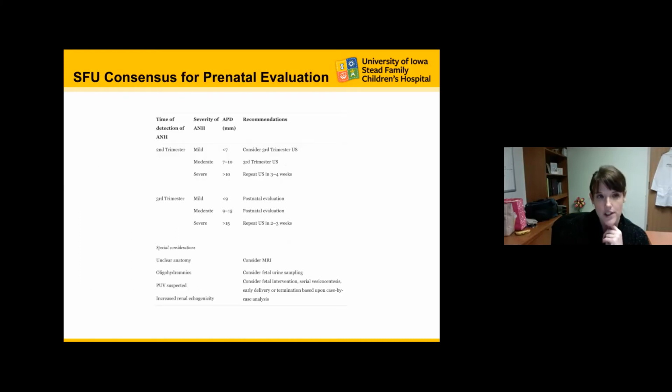Okay, so this is changing gears a little bit. In 2010, the SFU created a consensus statement for prenatal evaluation of hydronephrosis and essentially used those APD parameters and gave guidelines to the obstetric community as to how often to obtain prenatal ultrasounds going forward.